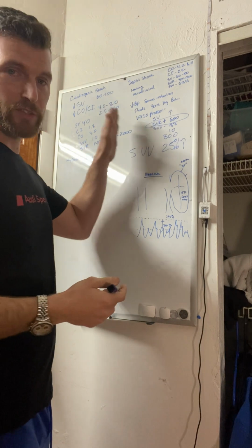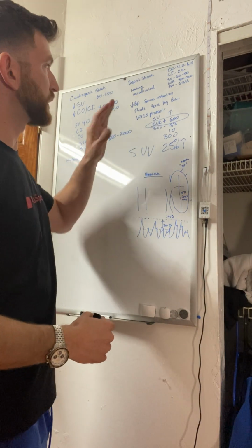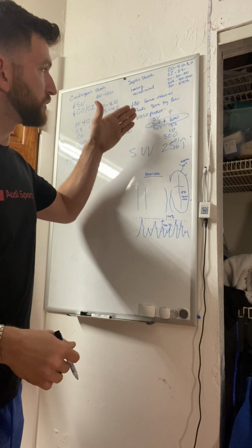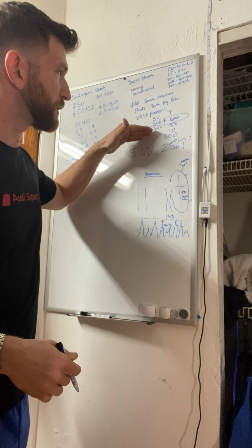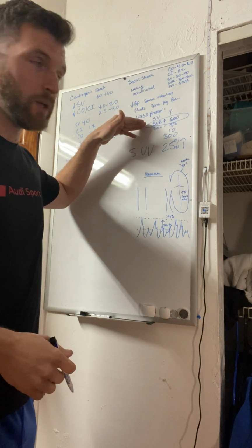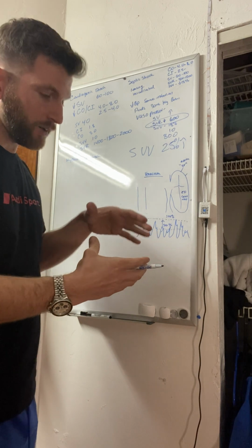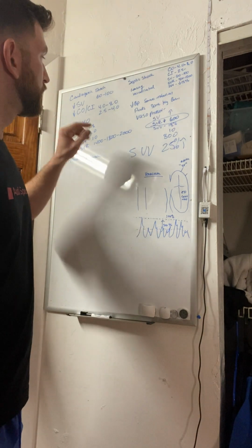So that's what we're looking at for septic shock. We see a low blood pressure, a source of infection. We give them a fluid bolus. They continue to be hypotensive and in shock. You start vasopressors. On your Vigileo, you're going to see a stroke volume that may be a little low, but maybe normal. An SVV that may be a little elevated or maybe normal. But the SVR is definitely going to be low, because that is the vasodilation. Remember, lower SVR numbers, lower vasoconstriction. Higher SVR numbers, more vasoconstriction, or the tone of the vessel is better.